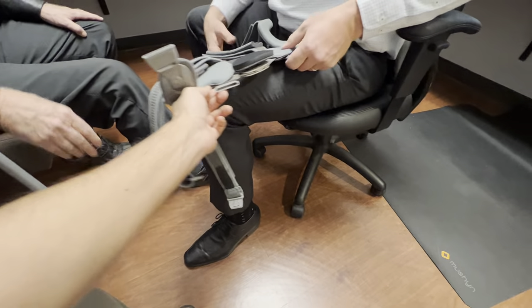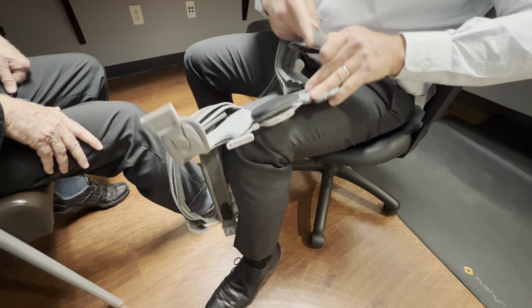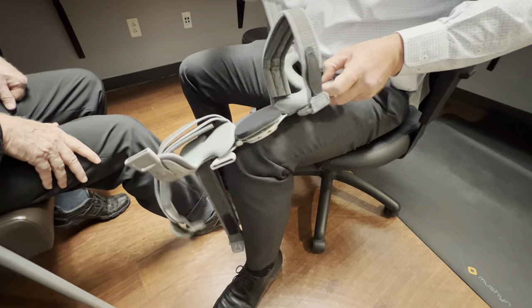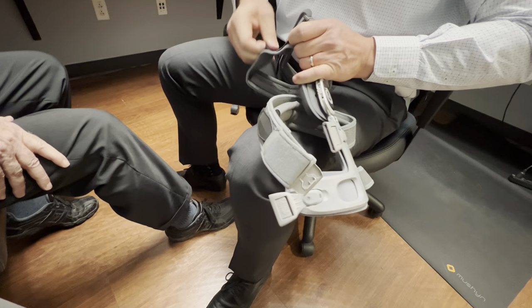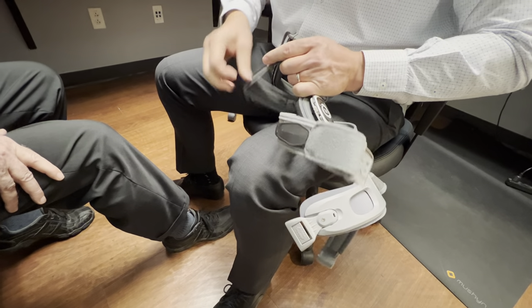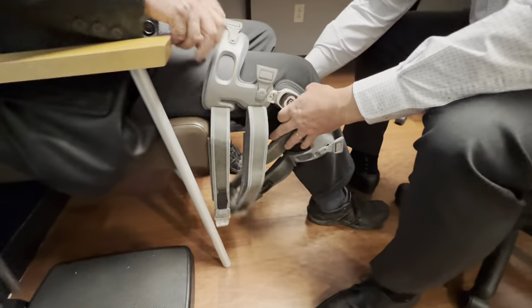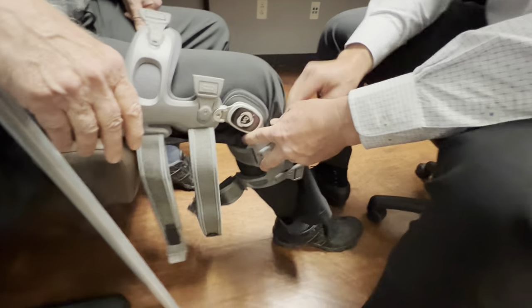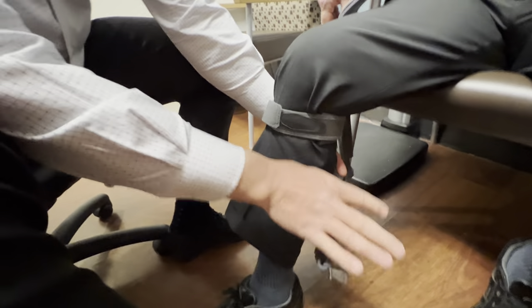There should be a clip on here — yes, it is. Okay, so this is the bottom two straps and we're just trying to get this out to where it terminates in the front, not on the side, so that it's easy for them to grab.